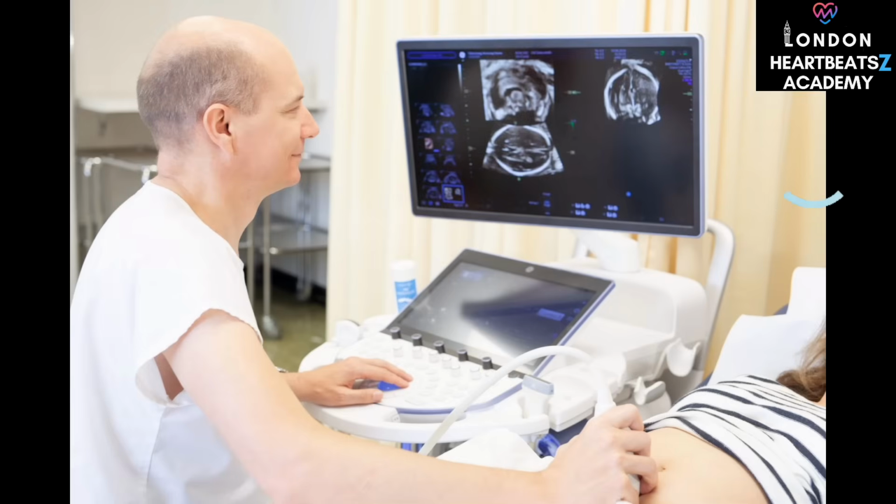Pretty much. And it's fundamentally different from technologies like mammography, which uses X-rays, or CT scans, which also use X-rays and are great for detailed cross-sections, or even MRI, which uses powerful magnetic fields and radio waves, and is often used for, say, highly detailed fetal brain development assessments later in pregnancy. So it's sound waves, not radiation like X-rays or CT.